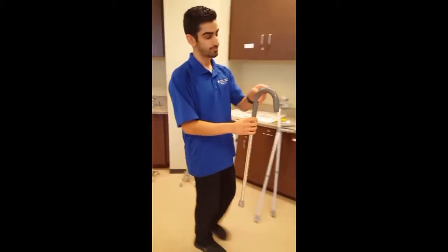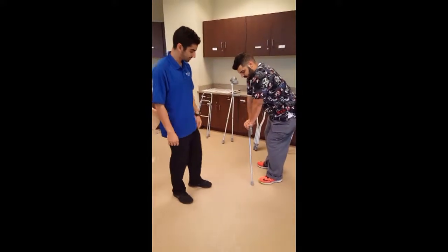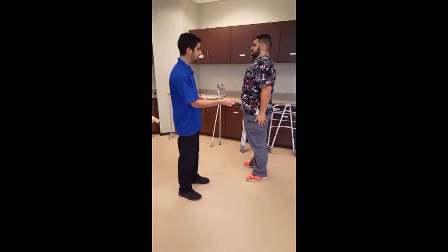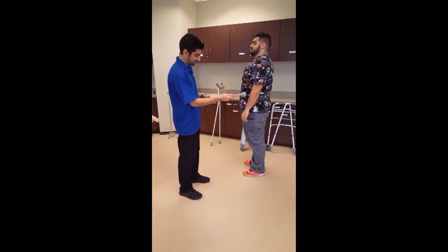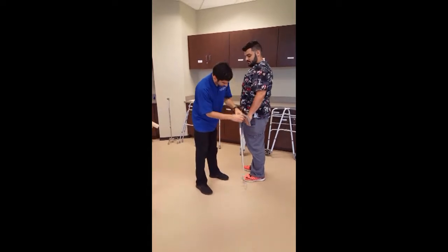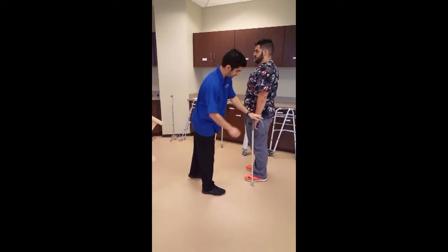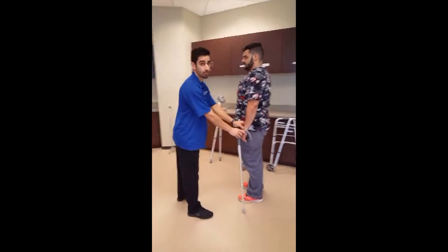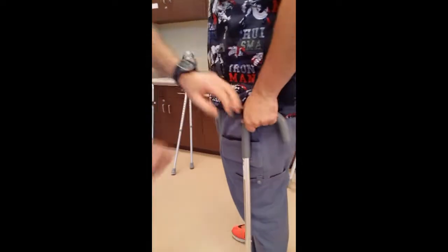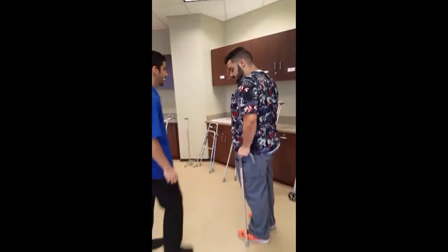So for Jamil, this device is not good. So we'll just set that for him. Stand straight, Jamil, look straight. And I'm just going to estimate right here. Let me go a little bit higher. That's about at his ulnar styloid, and then his greater trochanter is right here, and this device is properly fit for him. This general rule will work for most of the devices.